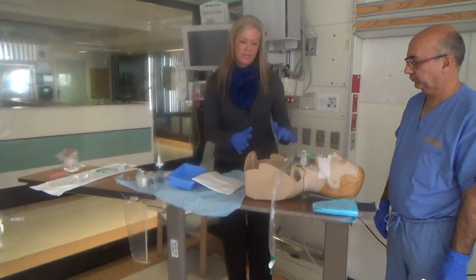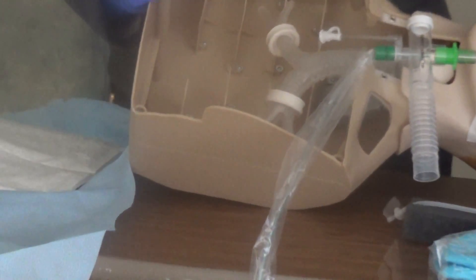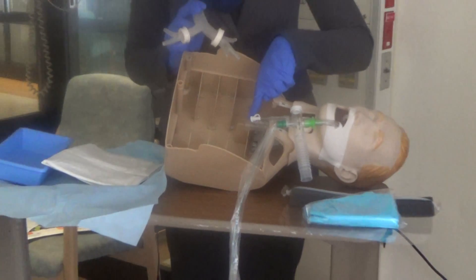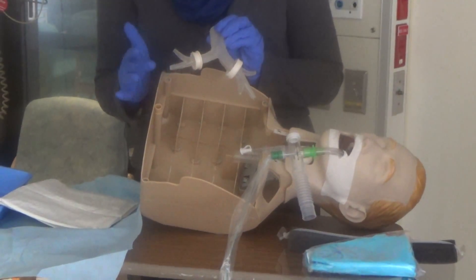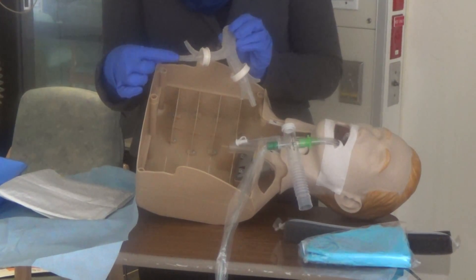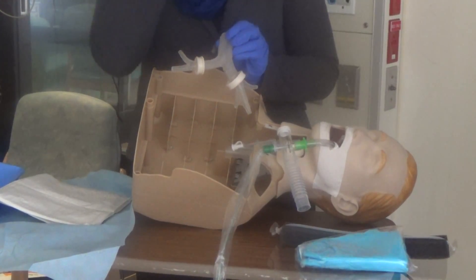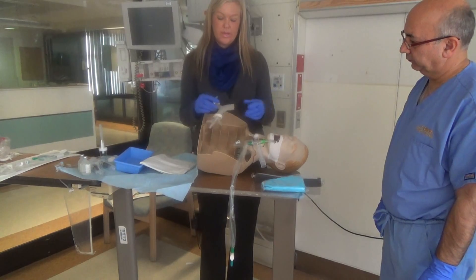Before we get started, I want to give you a good visual of where we are trying to go with this procedure. Inside my patient model, you can see the end of the ET tube, the carina, and then the option to go right or left. The idea with this procedure is to get as distal as possible into the airways. The pneumonia or organism is not in the trachea or ET tube — it is out in the distal airways.